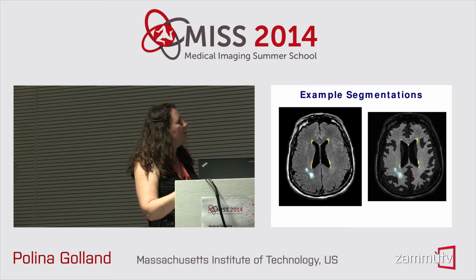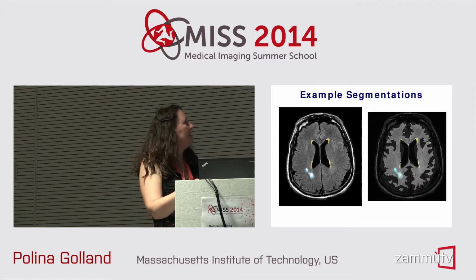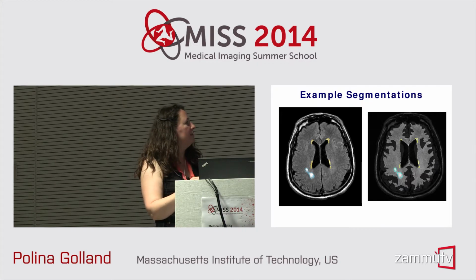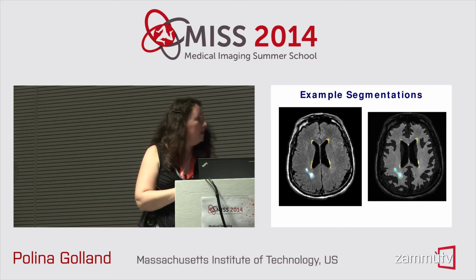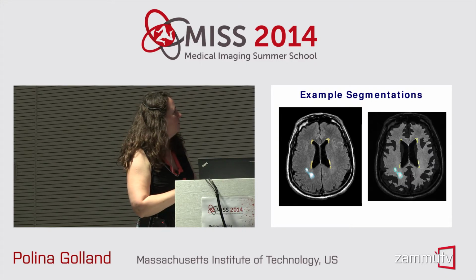I should say that the reason everything else looks kind of choppy is because we segment the white matter, right? So this gray kind of dull label is the healthy white matter. What you're seeing is a very faint image, and on top of that there's healthy white matter, and we're showing the outlines here, again, in yellow and blue, so that you can look at them and say, oh, this looks pretty good. I'm actually comfortable saying this is our typical example at this point.